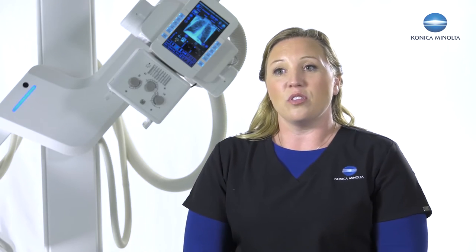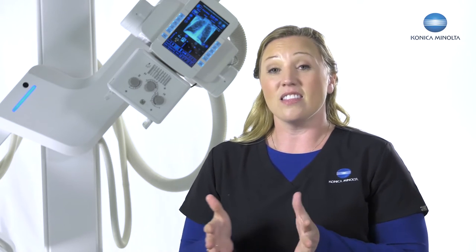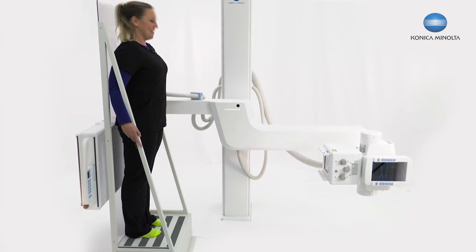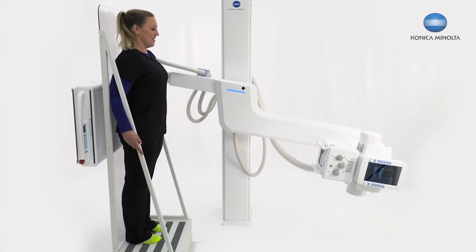One thing we've been able to do with the third generation U-Arm is control the SID from the detector side. This allows us to keep the same SID throughout the entire stitch process, making for even better image quality, better patient comfort, and just a better experience overall.